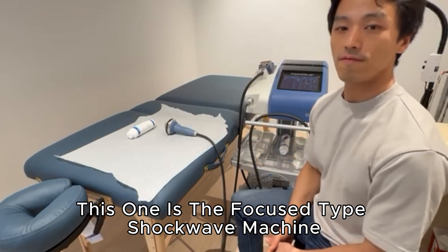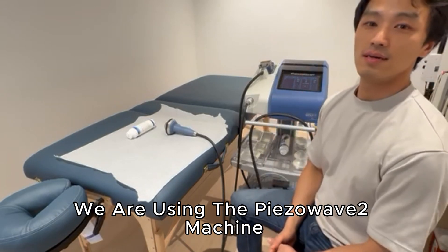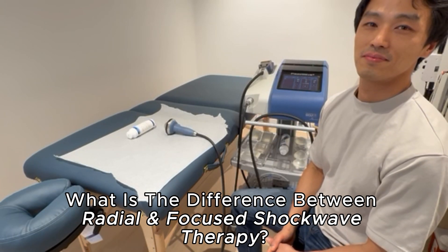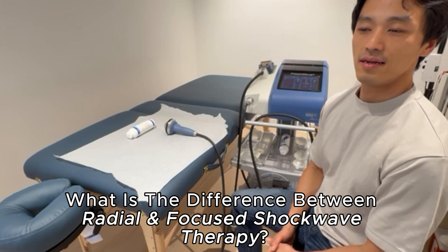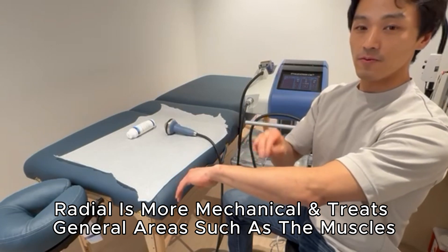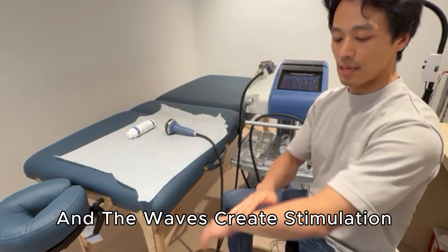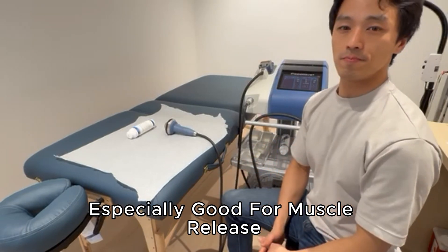We are using the Phase Wave 2 machine. What is the difference between radial shockwave therapy and focused shockwave? Radial is more mechanical — it literally hits you, makes a little stimulation, and is more for the superficial layer, especially good for muscle release.